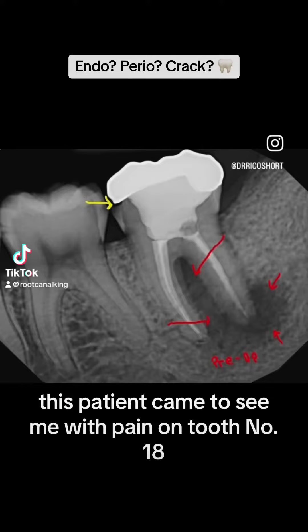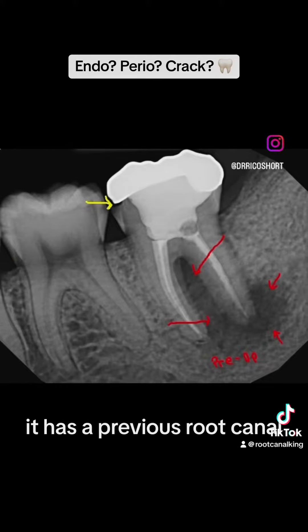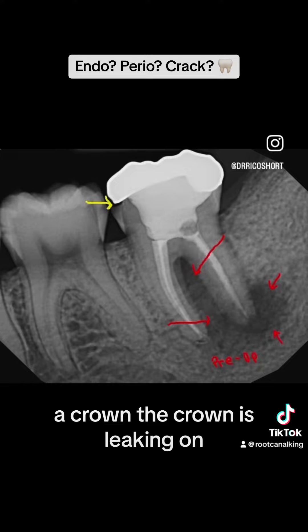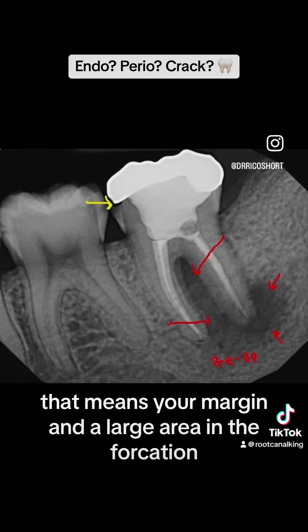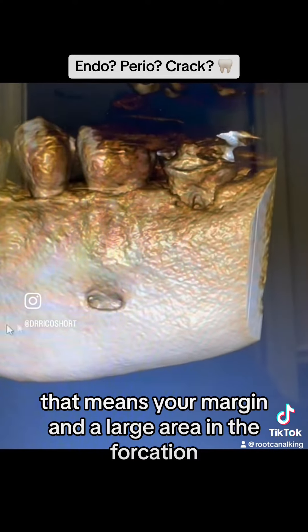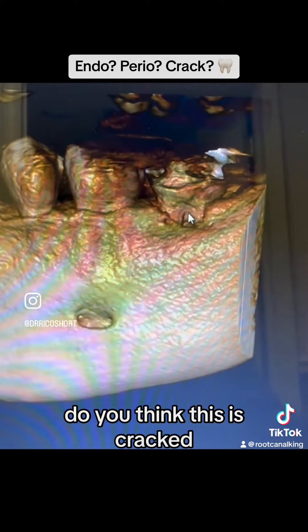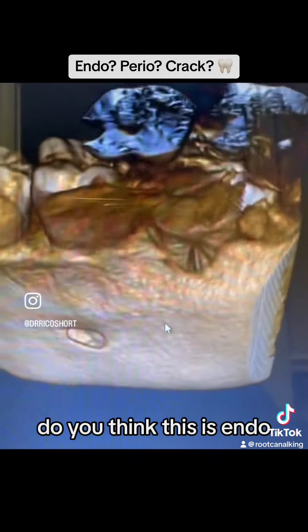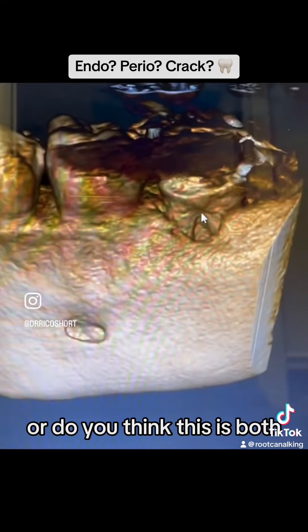This patient came to see me with pain on tooth number 18. It has a previous root canal and a crown. The crown is leaking on that mesial margin with a large area in the furcation. So the question is: do you think this is cracked? Do you think this is perio? Do you think this is endo? Or do you think this is both?